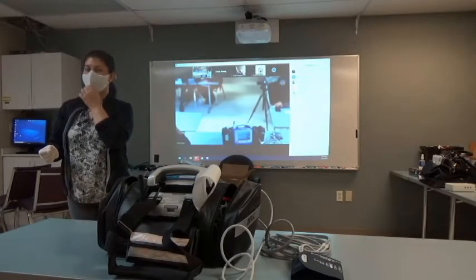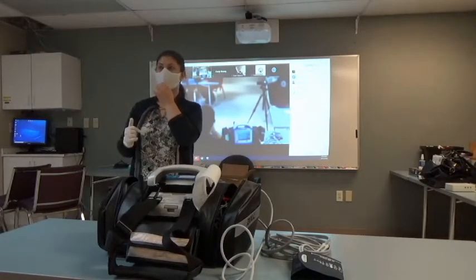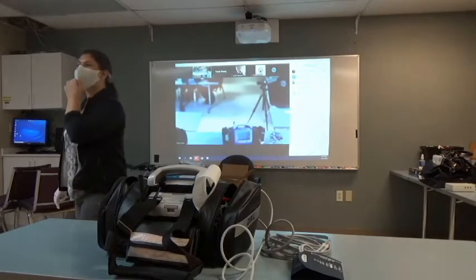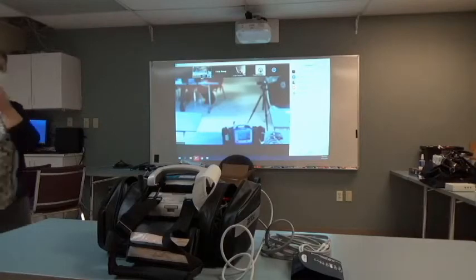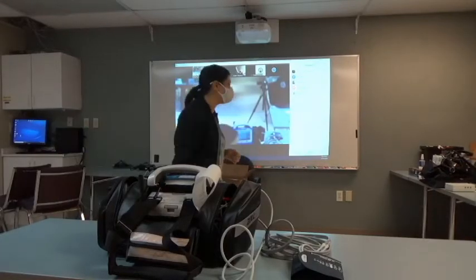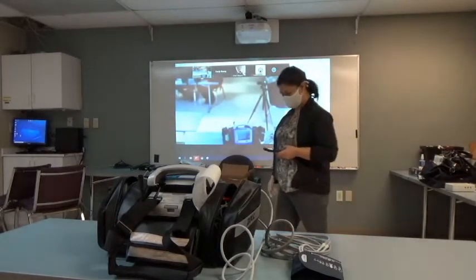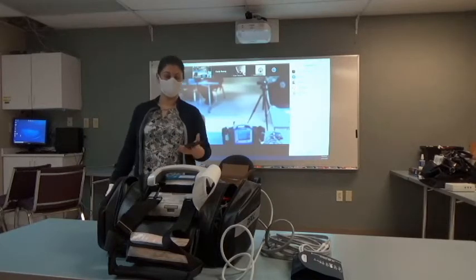All right. We are going to move on to 12 lead transmission. The roll of paper down at the bottom will give me another copy of the 12 lead that I just printed out, if I need to hand a copy to somebody else. Now we're going to do 12 lead transmission. Let me make sure my phone Wi-Fi is on.